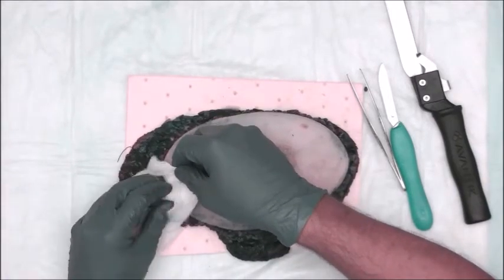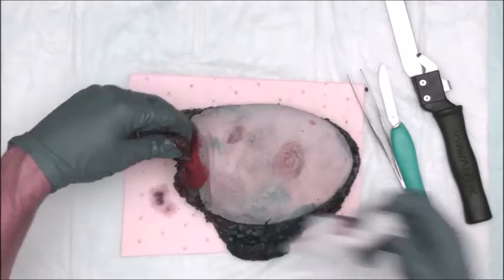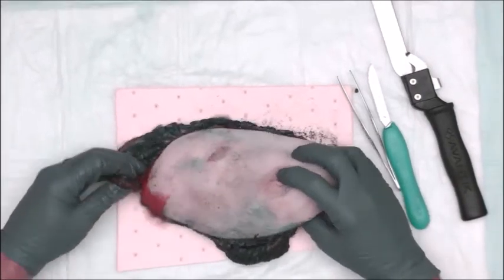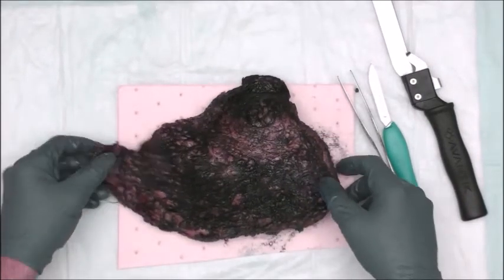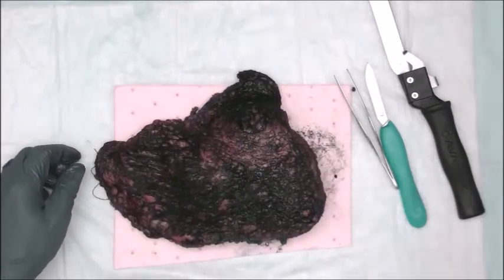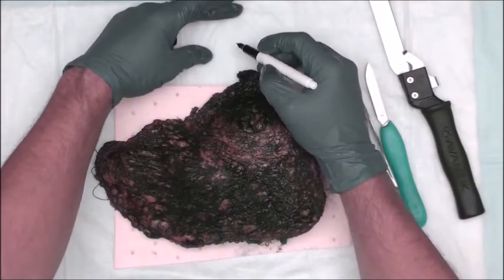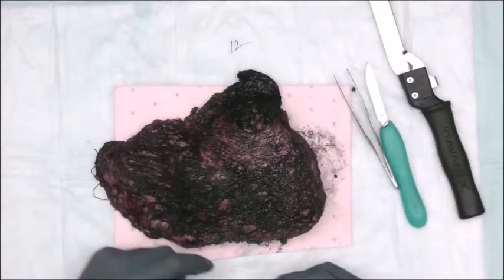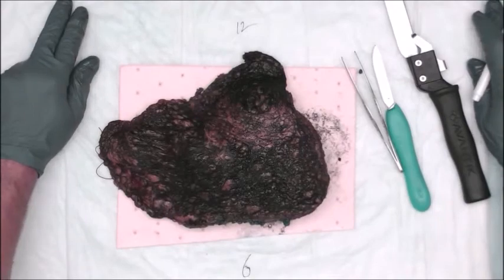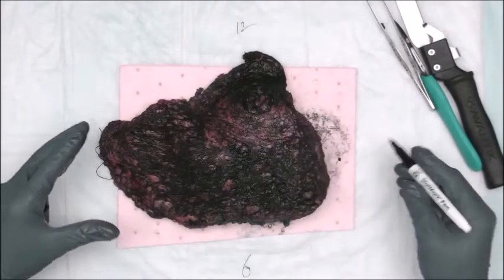Okay, so now that the specimen's fairly dried off, like I said, we section the specimens posteriorly. So this is left breast. So I'm going to put this face down like this. And what I also like to do, and you can certainly do this as well, is put some numbers here for the clock face so you can remember where you're at. There's a 12 there, 6 there. Okay, this is looking at it posteriorly, left breast.